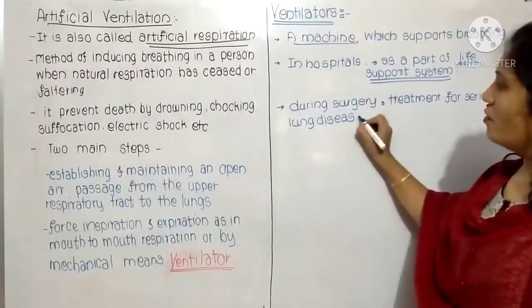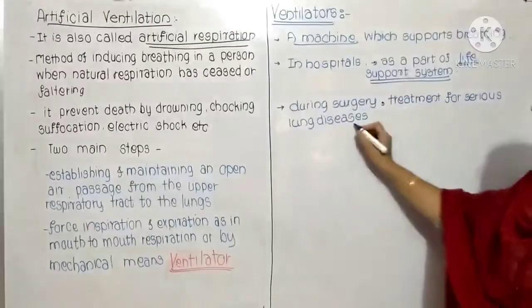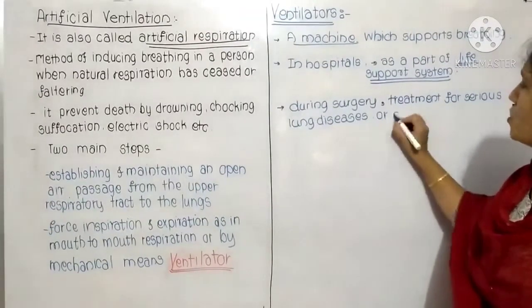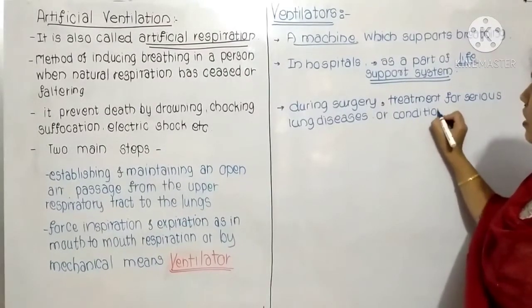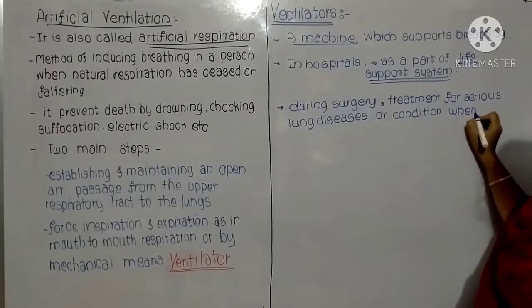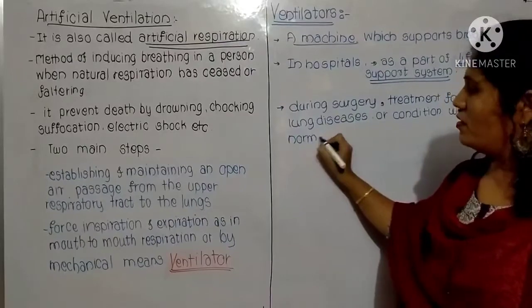If a person has a problem related to the lungs, it is useful, as well as in conditions when normal breathing fails.